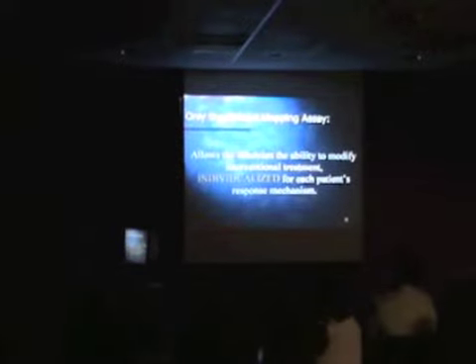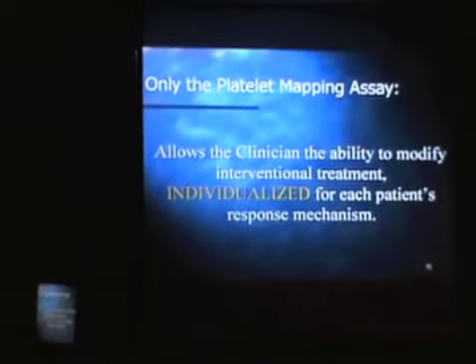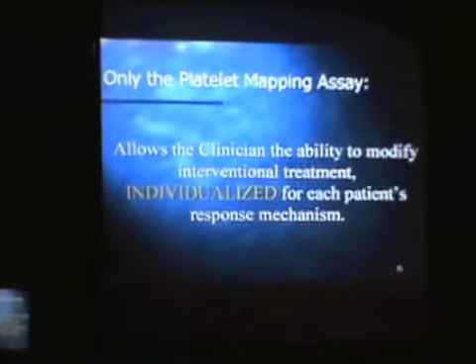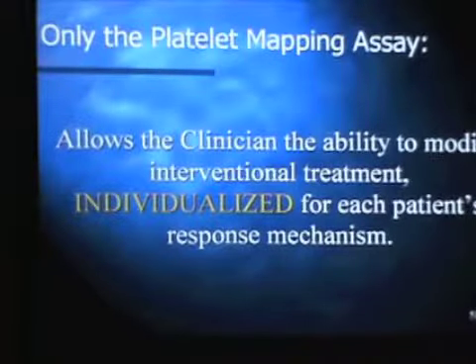So what the mapping allows us to do is individualize, allows the clinician to modify their interventional treatment and individualize it for each patient's response mechanism. And that's what's important. To just give an empirical dosing of drug because a society says this is the way to do it does not mean that it's going to work on that patient.